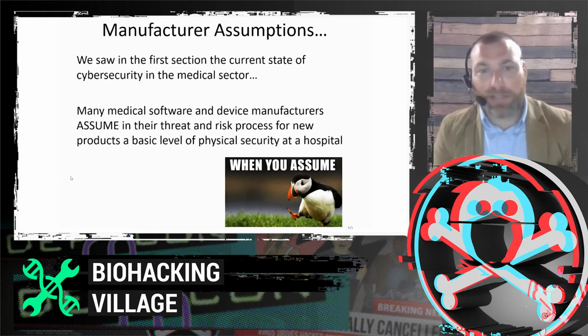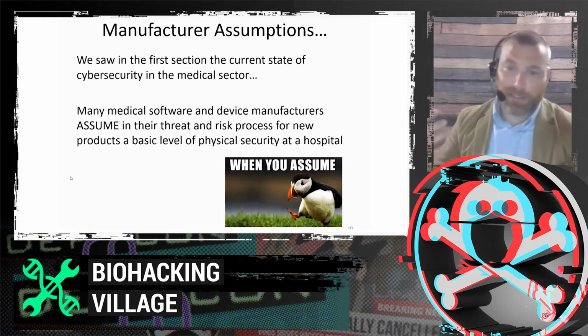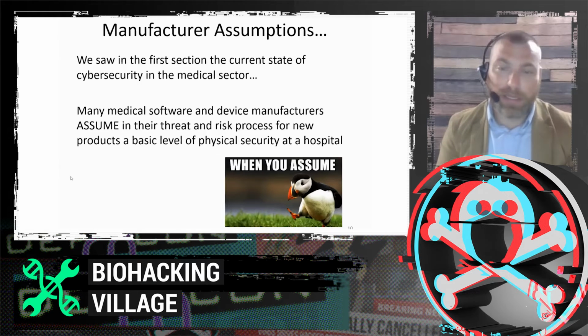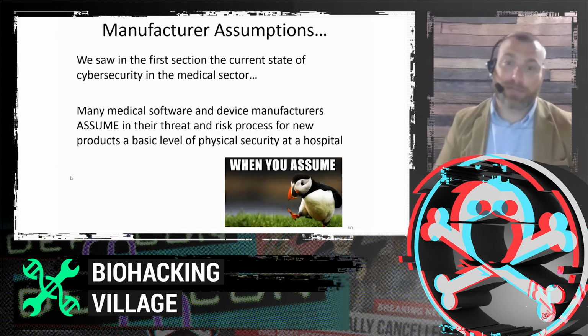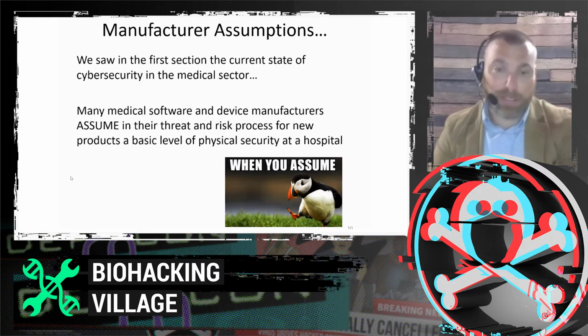Well, medical device manufacturers make certain assumptions when they create a medical device. They assume, as Helen was talking about in some of her past presentations, that a device is going into a secure environment. And that's not always the case. It's certainly going to vary. If it's maybe a large CT device, they might assume that it's going to be in a secure facility, or maybe in a secure laboratory.